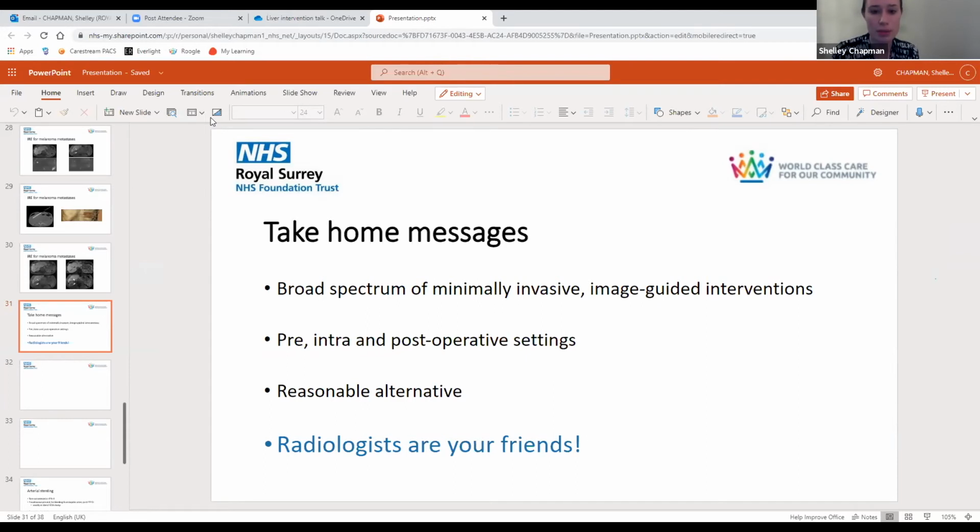And then for microwave, my preference is ultrasound, but that's because that's the way I was trained. I think it's easier, and you can move the probe with the breathing, so it's easier to pass the needles in. But you can equally do it under CT, often with a breath hold. Sometimes I notice that all the people going for ablation will get an ultrasound scan and not all the lesions show up on ultrasound. Would you sometimes use contrast-enhanced ultrasound, or would you go to CT in these situations?